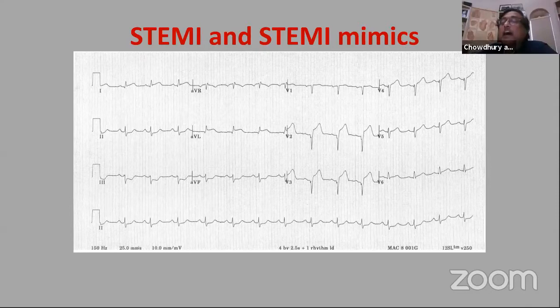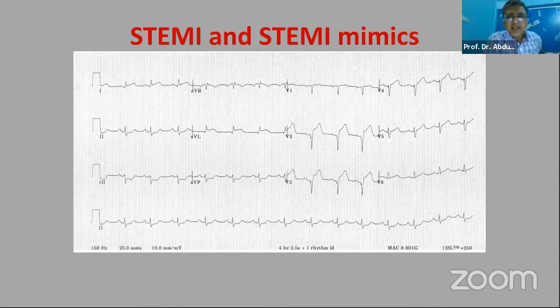So there is enough injury pattern in this. And along with the Q wave, it will be coded as recent anterior ST segment elevation. And I would even add lateral as well. Sir, one thing is there. Whenever you have a reciprocal change in the opposite lead, that strongly suggests this is the primary event. This is an acute event.